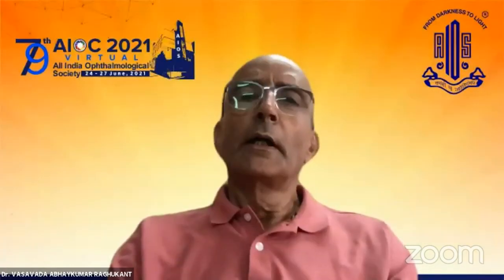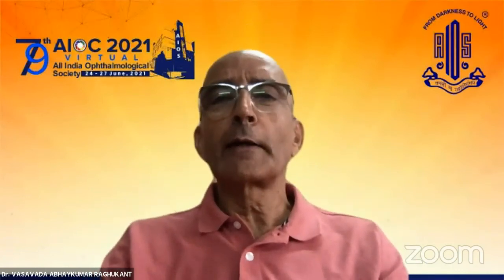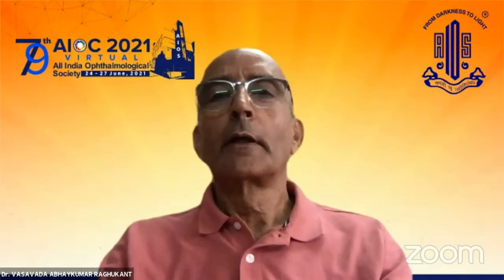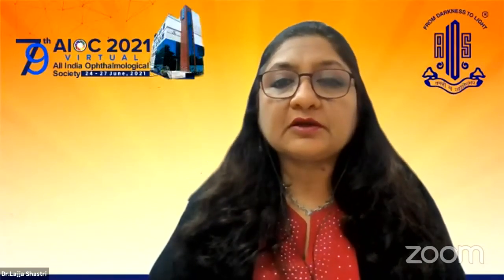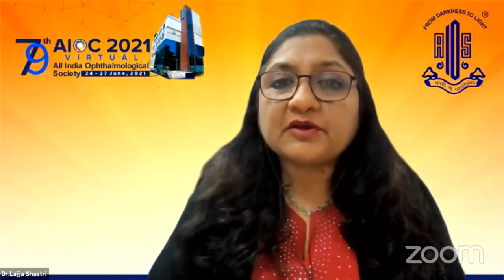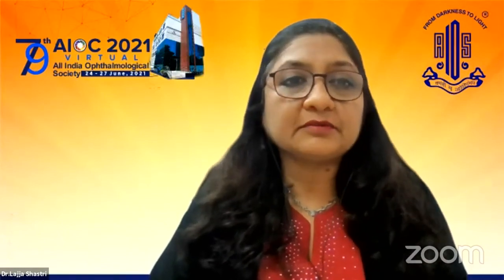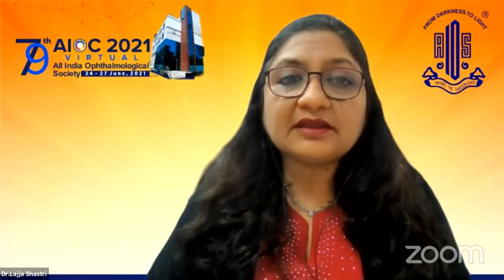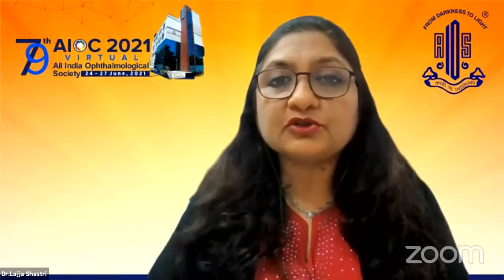Okay. Lajja, in your opinion, which are the number one or two pieces of equipment that you would put higher up on the list? So I would say that if somebody couldn't really buy a swept source optical biometer, then some access to topography is very important, because given that the astigmatism incidence is extremely high in our population of cataract surgery patients, if you have access to something that tells you the regularity of the astigmatism that you're dealing with, that would be a very important tool to have.